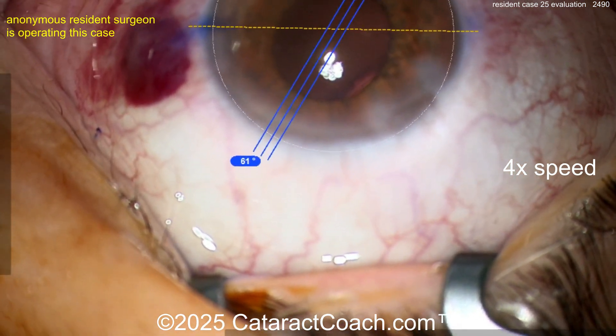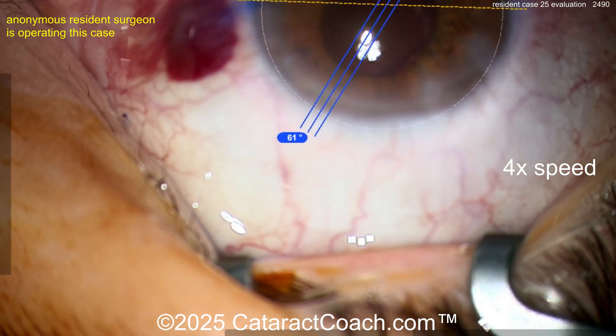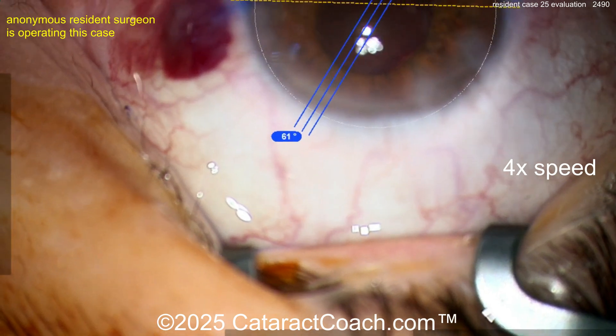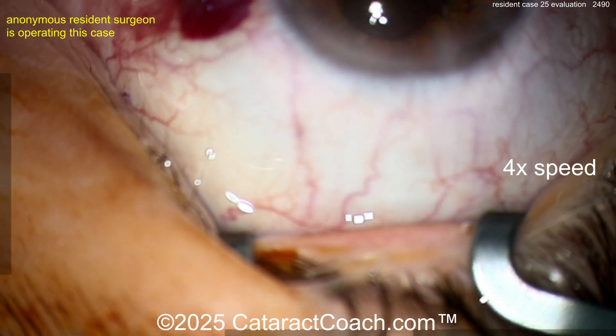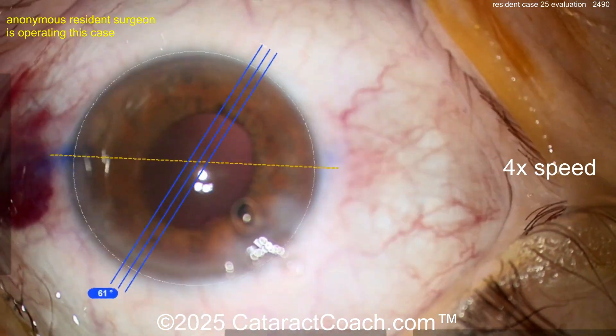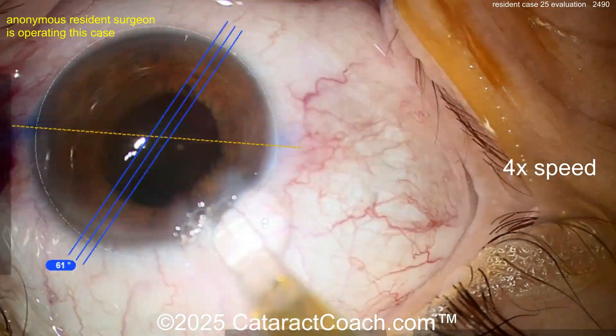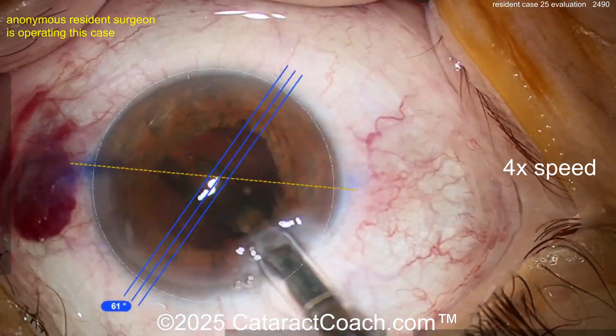You missed the eye with the injector — that's okay, you can reload the lens, no big deal. That's probably from the saying we have in English: haste makes waste. You're trying to hurry up and end up being slower. You want to be more efficient, and that comes by slowing down and being more meticulous.